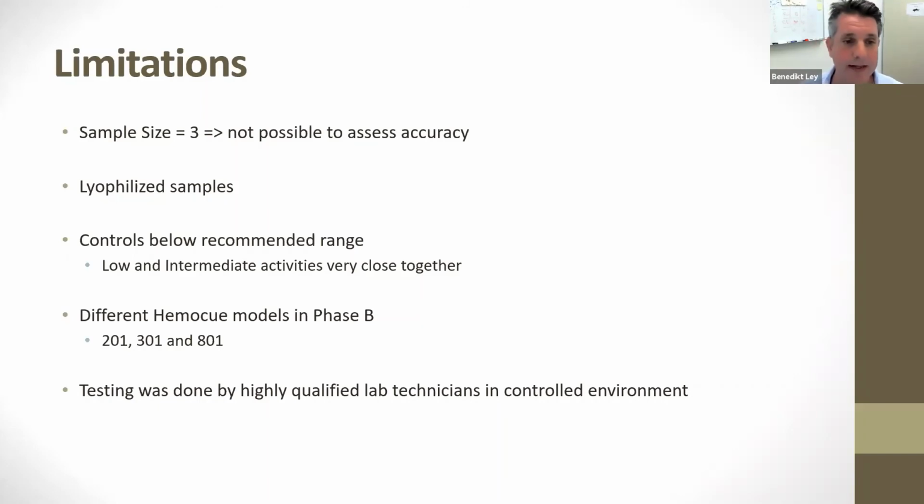And finally, testing was done in a highly controlled environment by very qualified technicians who had several years of lab experience. And while this will have improved our findings, the measurement procedure involves two critical pipetting steps, and these may introduce variation when the device is used in routine practice.